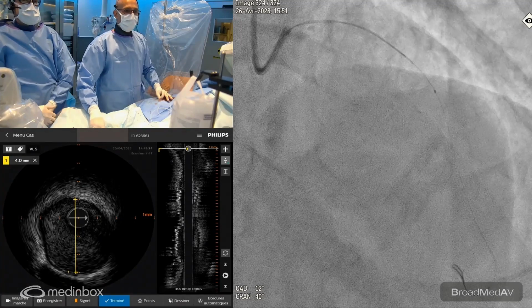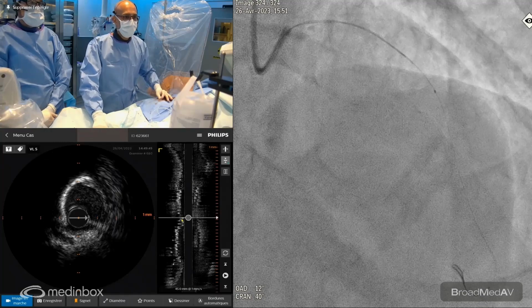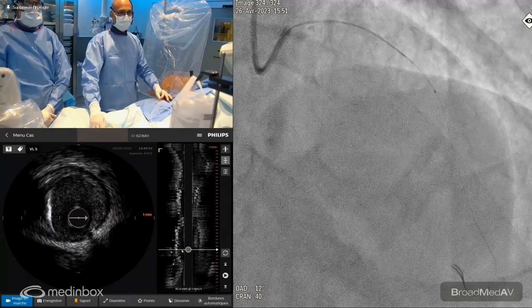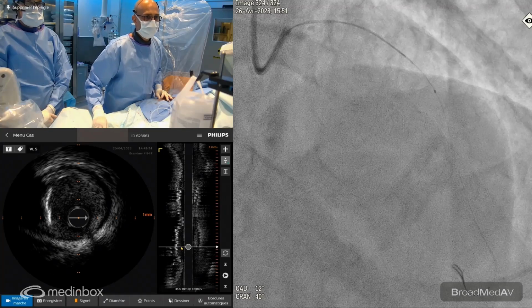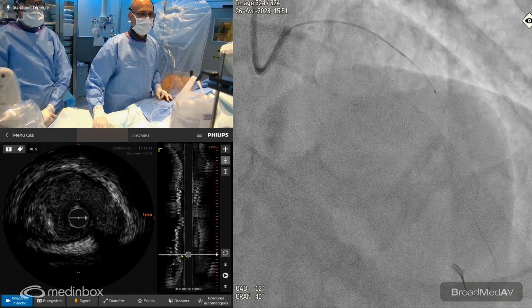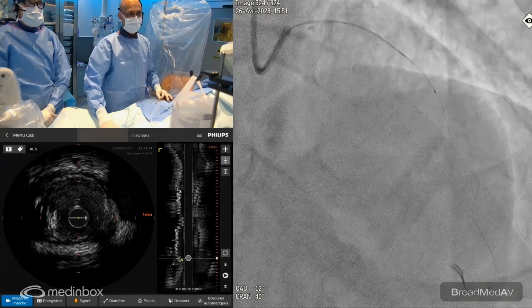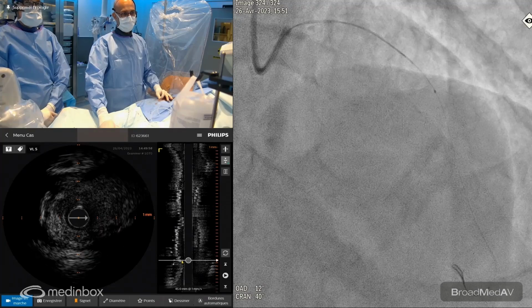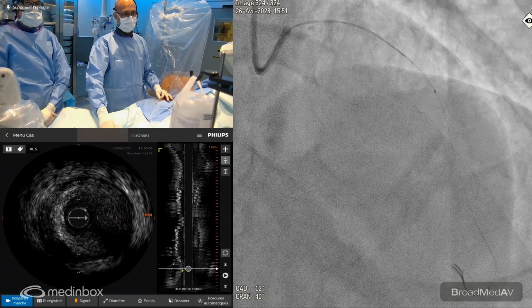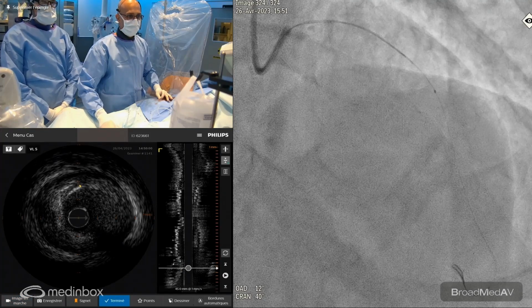Can I have a measurement of the left main, please? The proximal left main. Go further. Go down. More. Yeah. Let's get the beginning. No, go further down. Proximal left main. Further, go beyond. Yeah. There. And let's measure there. Go further beyond. Okay.